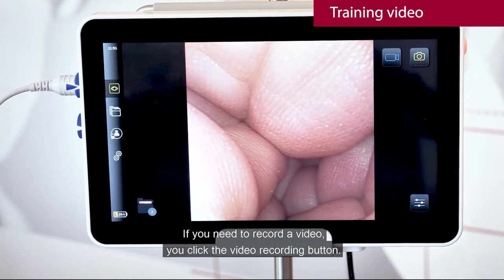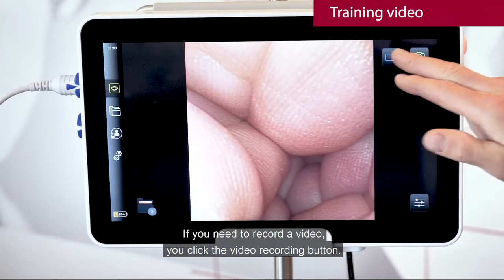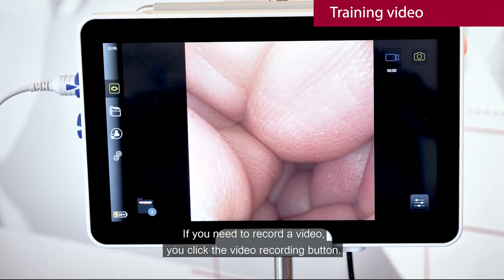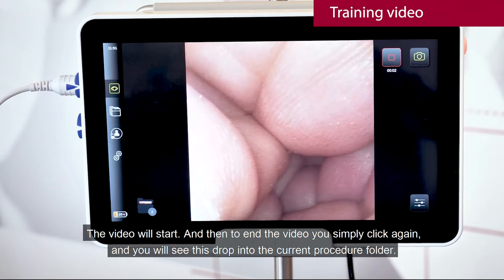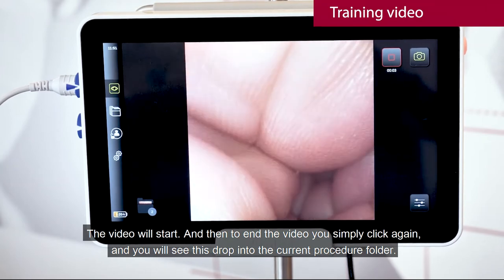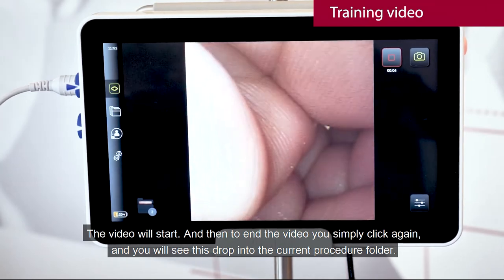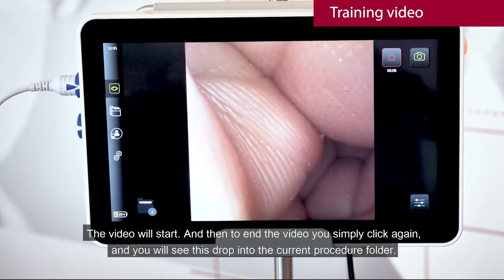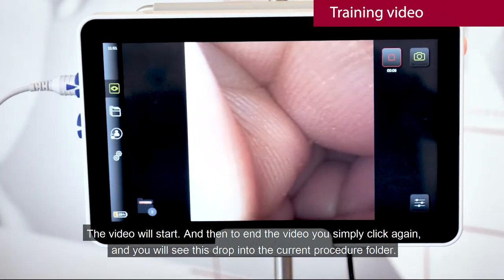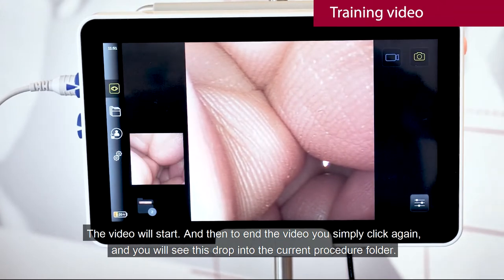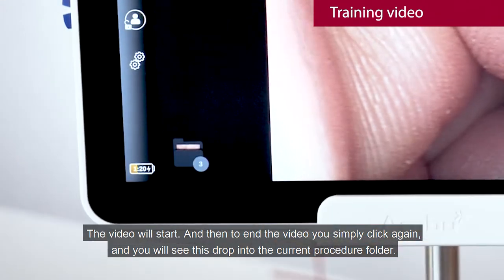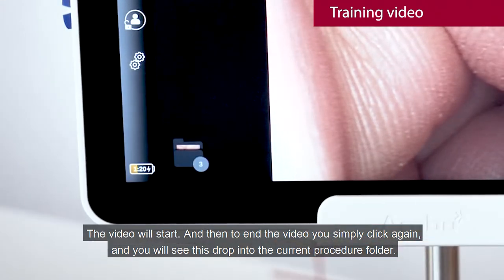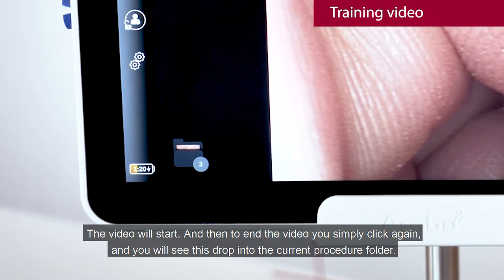If you need to record a video, you click the video recording button. The video will start, and then to end the video you simply click again and you will see this drop into the current procedure folder.